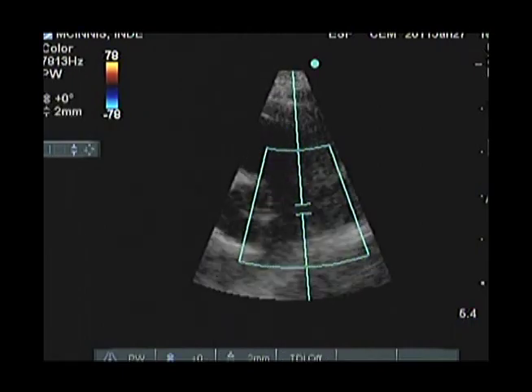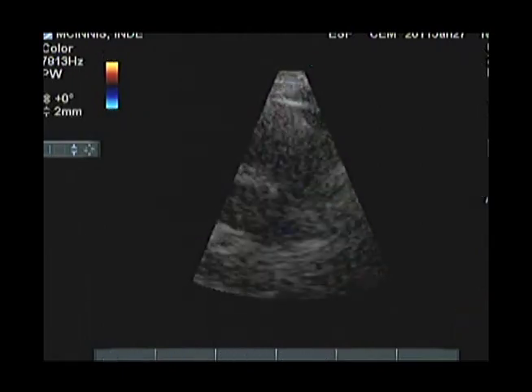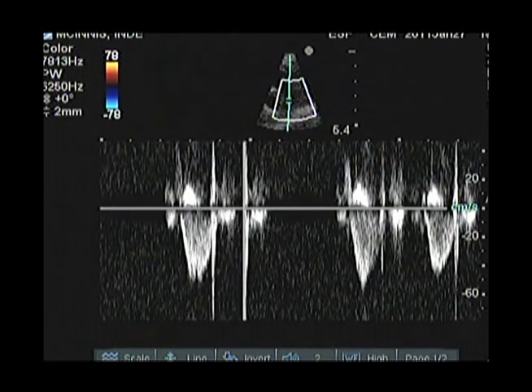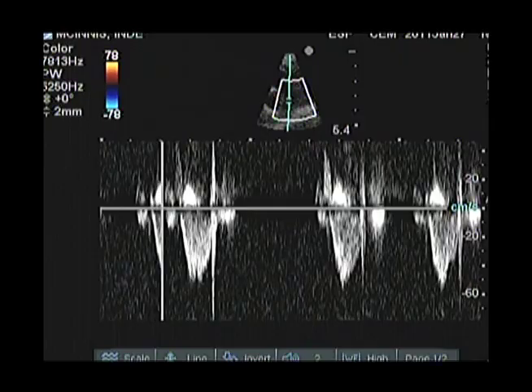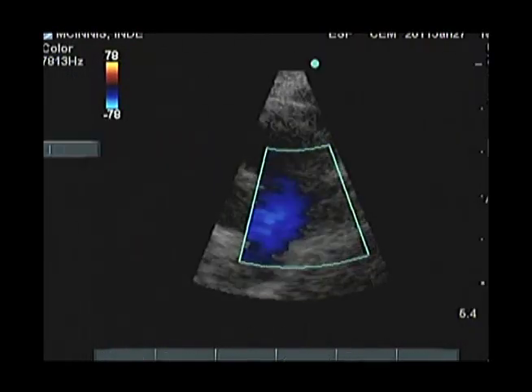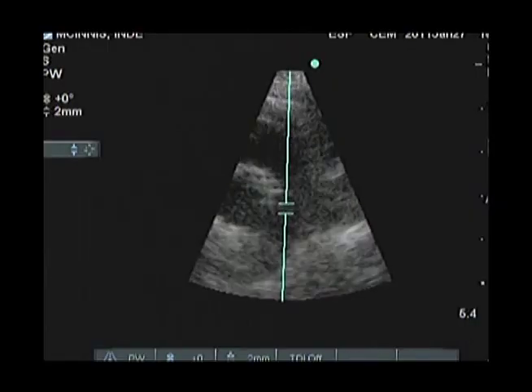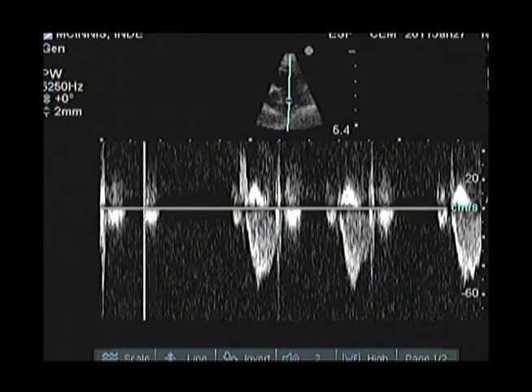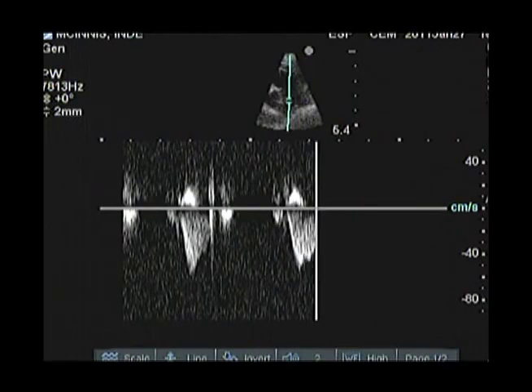Remember, if you use color flow simultaneously, you are dividing available computer capacity. If you turn color flow Doppler off, more computer capacity is available to increase the pulse repetition frequency or scale for spectral Doppler.